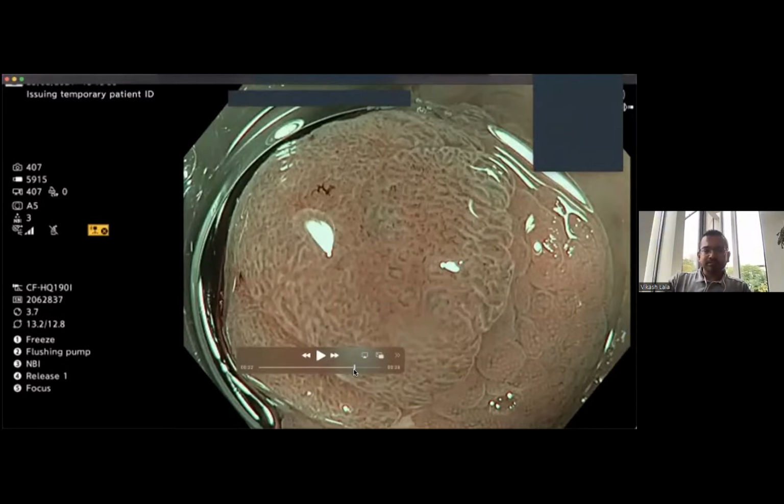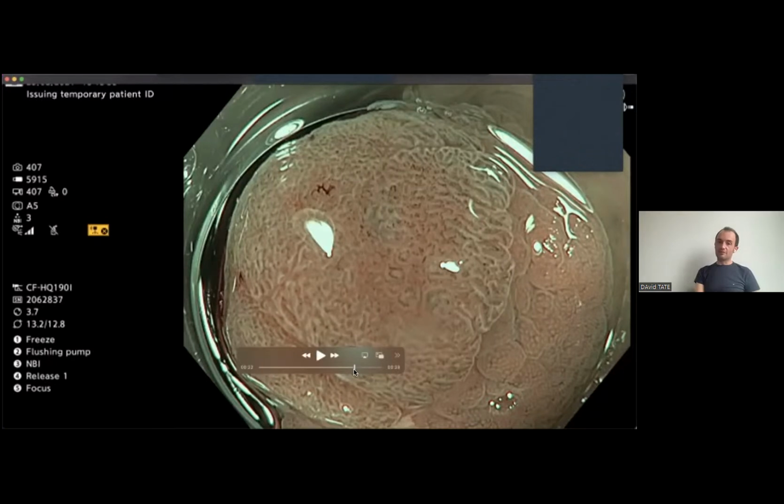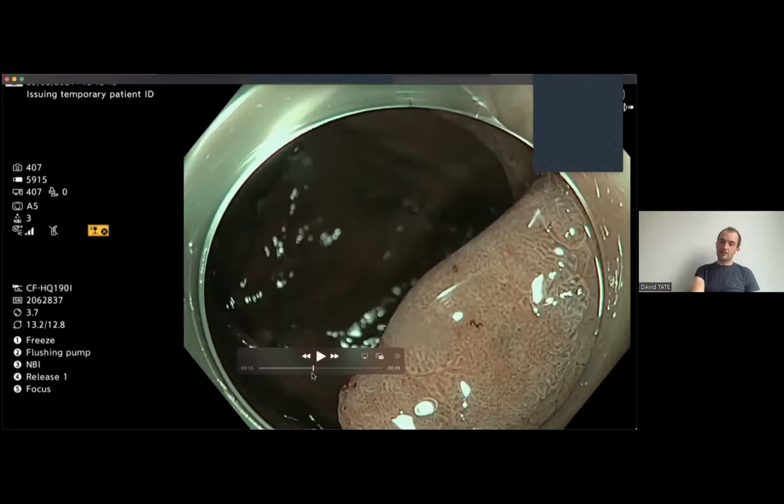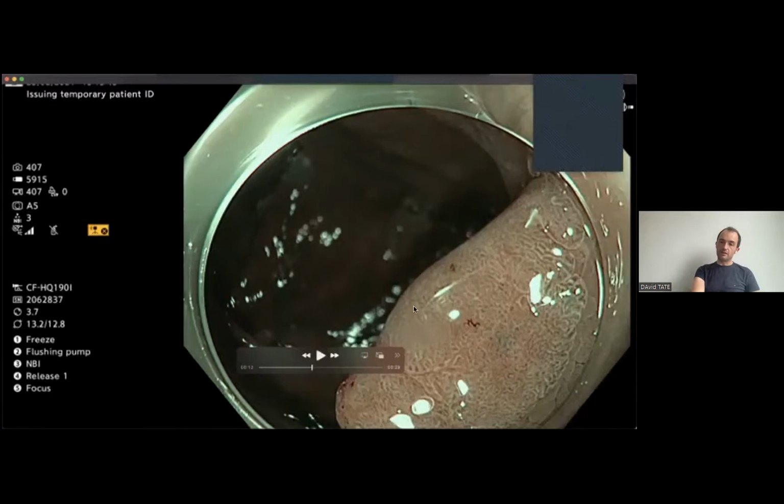So it's very important to notice that granularity is a difficult to interpret component of imaging polyps, and it's probably less relevant in this situation, but unfortunately our scoring system currently contains it, although we're looking forward to getting rid of it once we can figure out exactly how to communicate it better to people. In any event, in this case Vikash is right, it's non-granular, because when you come back off it, it's shiny and you can't really see the big bubbles within it, the big kind of nodules. I'm not talking about a big overall nodule, I'm talking about nodules within the structure of the polyp. We'll show you some granular ones in a minute so you can contrast.